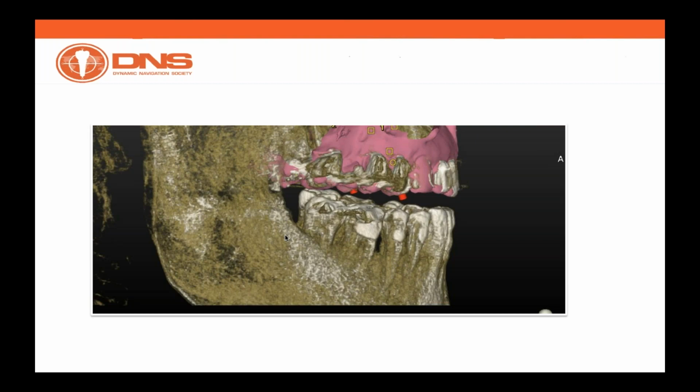we are very familiar since almost one year now with the idea of tracing. In other words, we are familiar with the idea that instead of having a patient with a CT marker at the time of the CBCT, we do have a chance to work on a standard CBCT and then register patient anatomy after the CBCT.